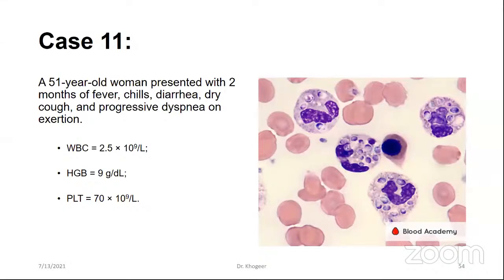Okay, is the microscope going to be dependent on a machine that prepares slides and sends them electronically to the doctor and clinician? Regarding this question, yes. Nowadays there is an era of technology, something called digital pathology, where they can use artificial intelligence.